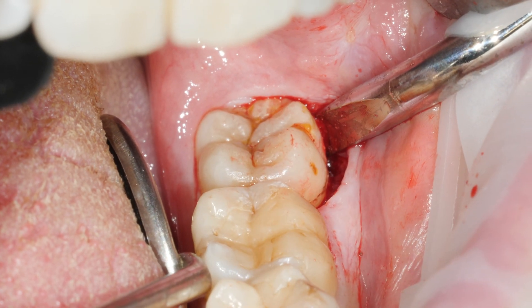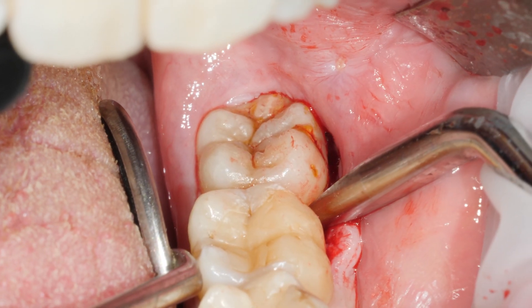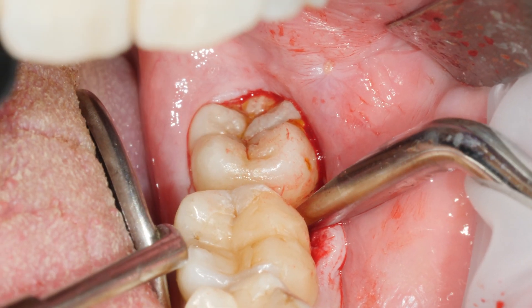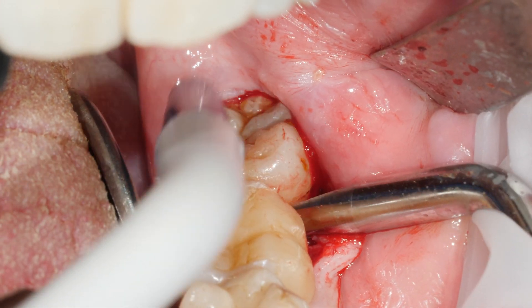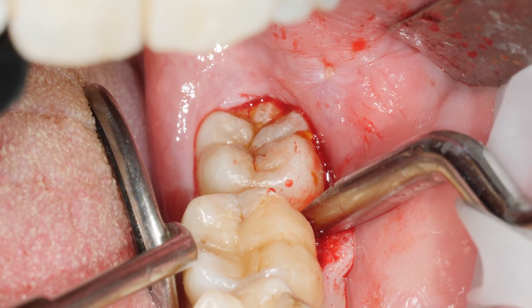Using the second insert and its concave shape around the tooth, we can see that there is a major mobilization — a major mobility of the tooth.